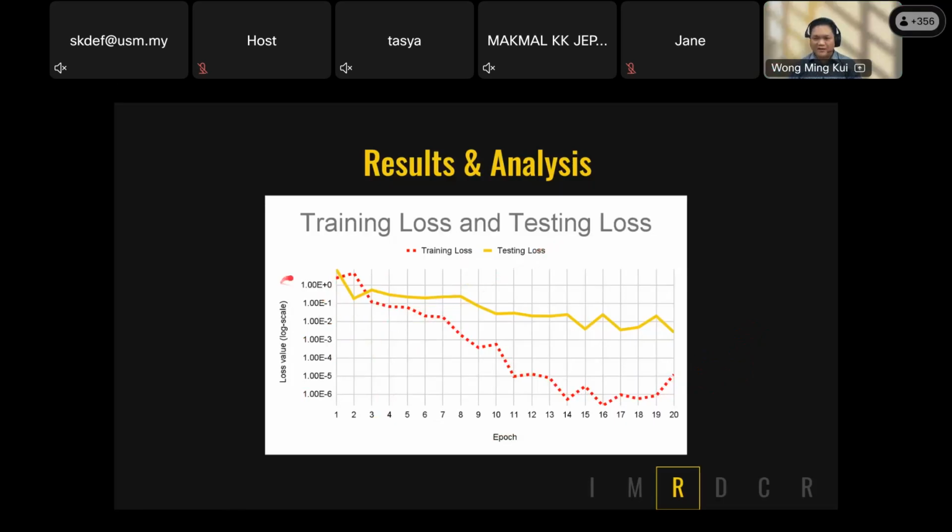At each cycle, the model is being built. Once the model is built, we test it on the data again. So this is the testing loss for the model. The testing loss is also reducing, but it seems like it plateaus out here.